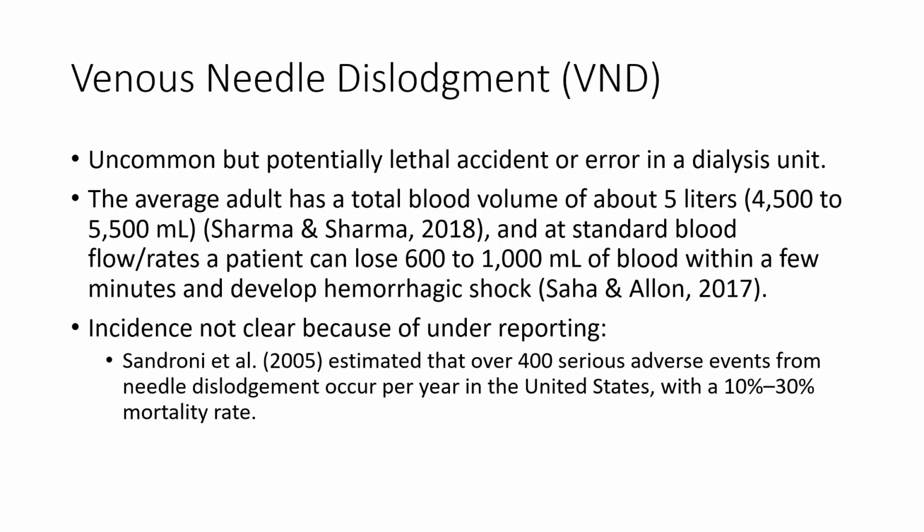The actual incidence of venous needle dislodgement is difficult to estimate because of underreporting, but in 2005, one researcher estimated that about 400 serious adverse events from needle dislodgement occur per year in the United States, with a 10 to 30% mortality rate.